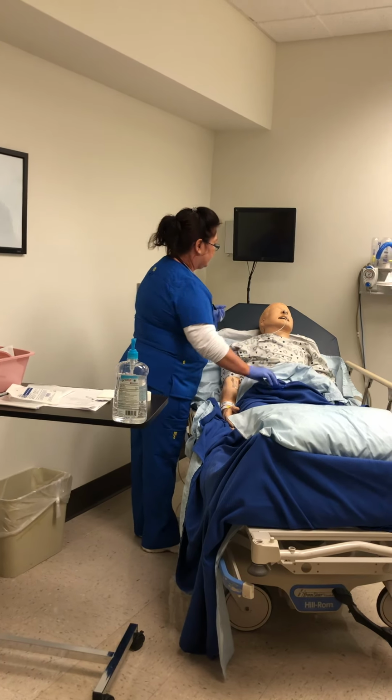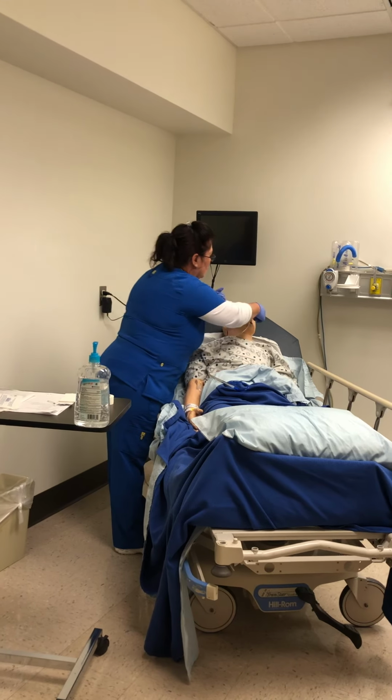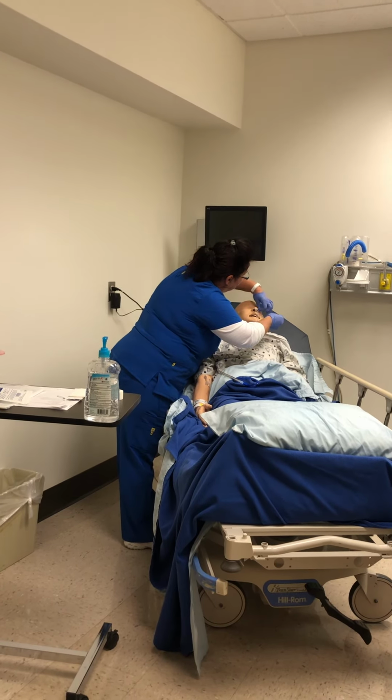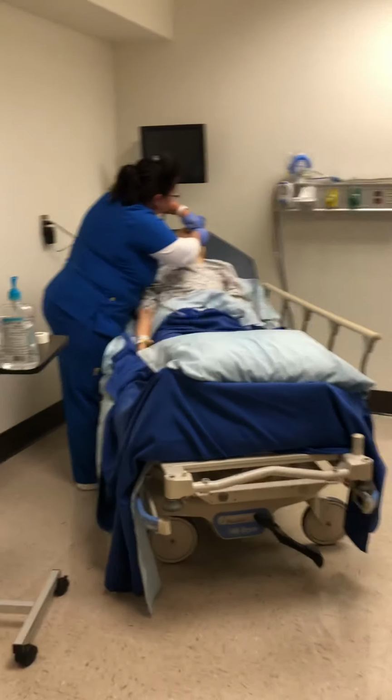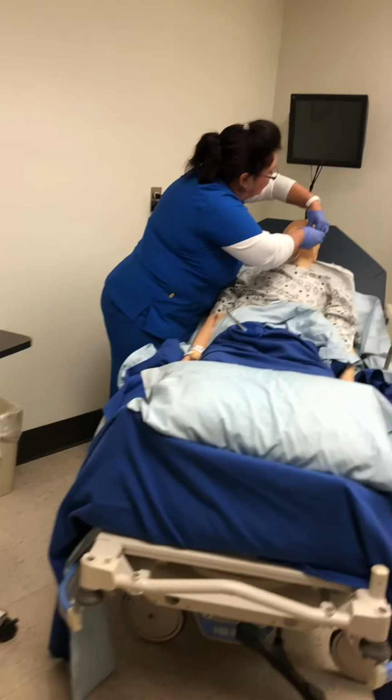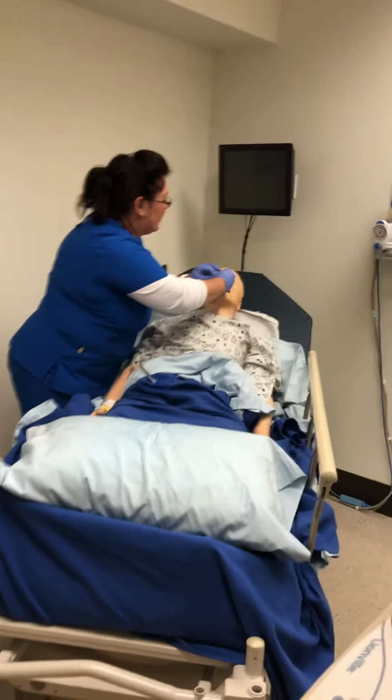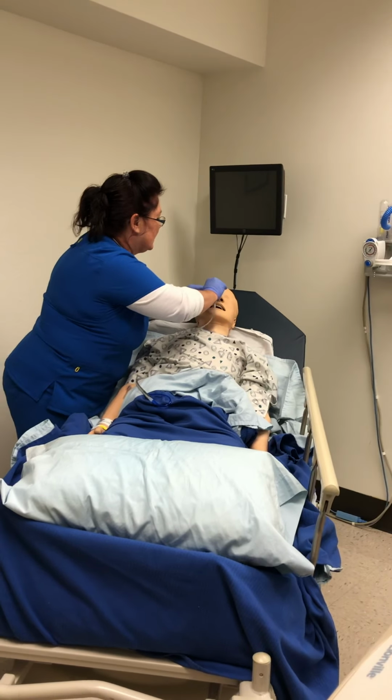Okay, Shirley, I'm going to take off the nose with the sticker using the adhesive. We're going to wipe this off so it's not sticky.